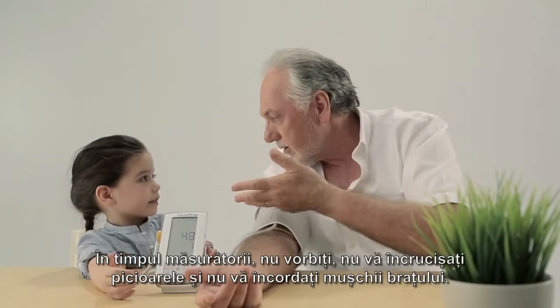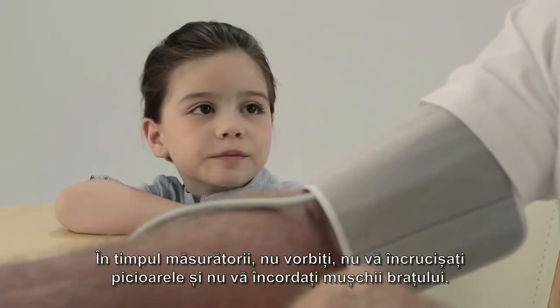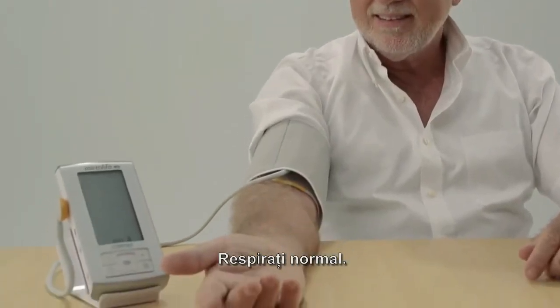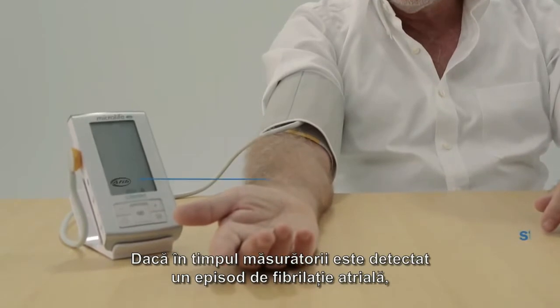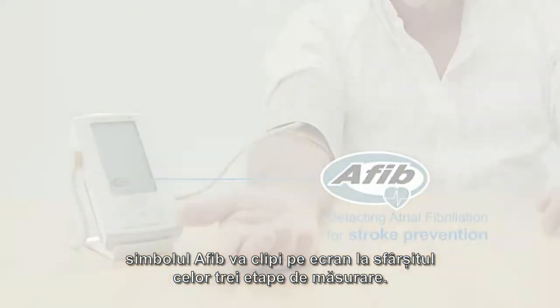During the measurement, do not talk, cross your legs, or tense your arm muscles. Breathe normally. If AFib is present during blood pressure measurement, the AFib icon is displayed flashing at the end of the triple measurement.